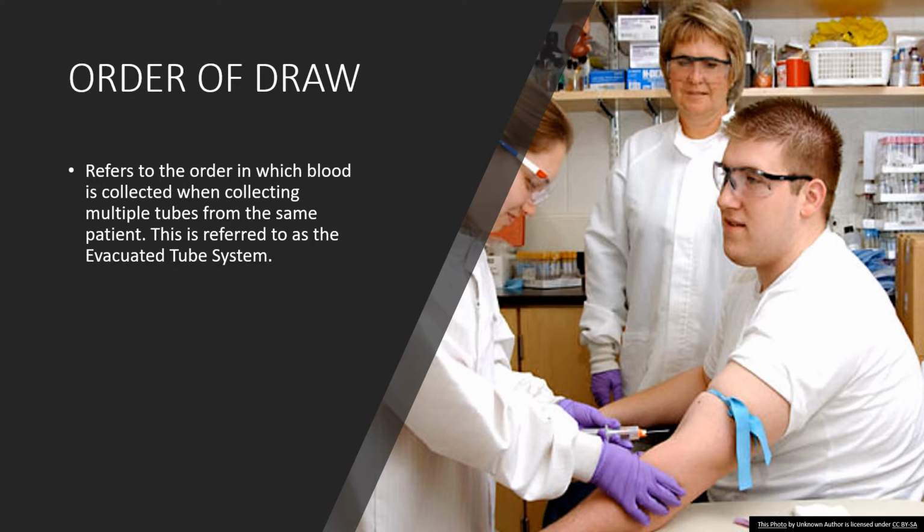So then what you do is when your tube is full, and it depends on what type of tube it is, whether it needs to be 100% full, but those tubes are set so that if they are working properly, they will draw the set amount if it's supposed to draw to 100%. There's other tubes that you only have to fill halfway full, and we'll go through all that.